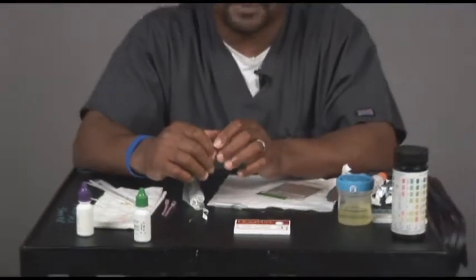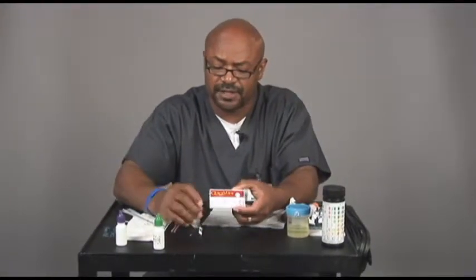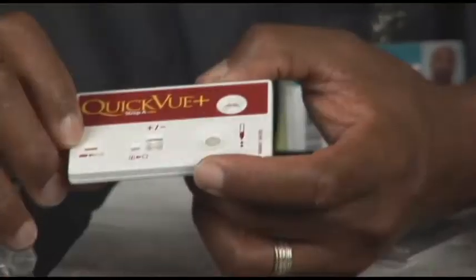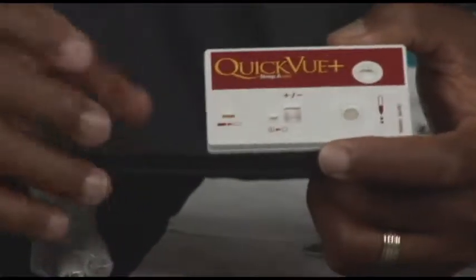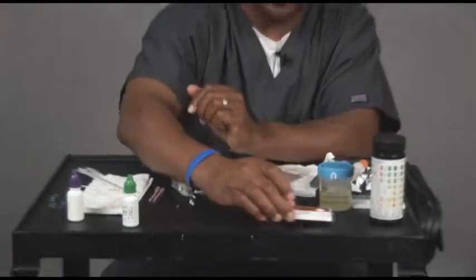Now this test takes usually 5 to 10 minutes before it results out completely. And the way you know when it's completed, you have an extra little window over here which will turn dark green or navy blue once it is completed. So that is the rapid strep test.